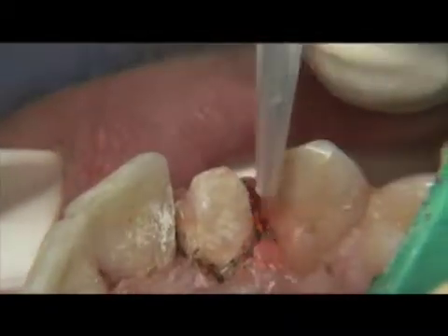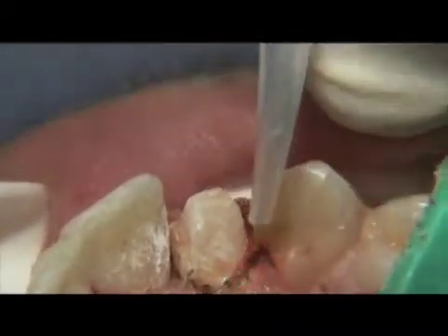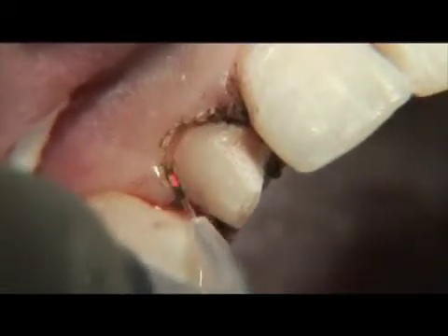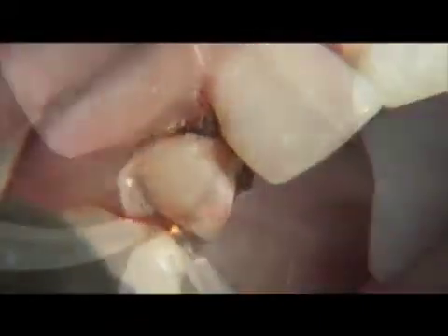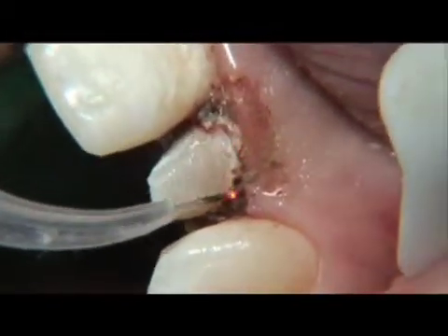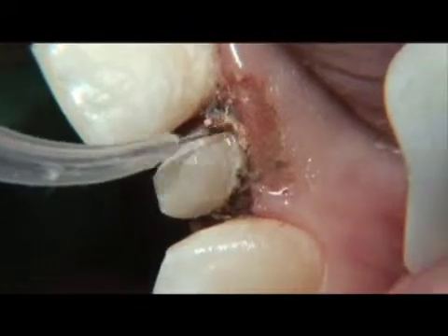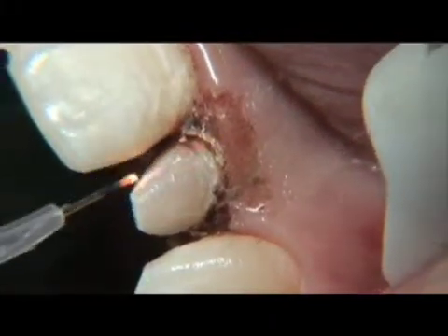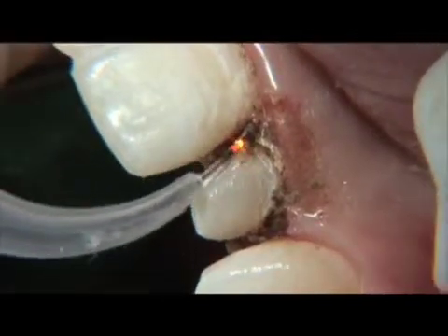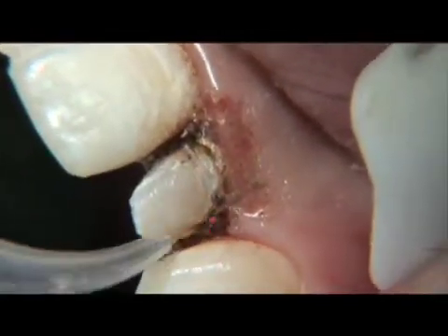Here the tip is placed parallel to the long axis of the tooth and moved gently in a brush-like motion. Occasionally, you will see the fiber tip glow — this is an indication you need to pause for a moment and clean the tip off. Doing so periodically optimizes the cutting efficiency of the fiber. After you've completed troughing, you are now ready to take impressions of the prepared tooth.